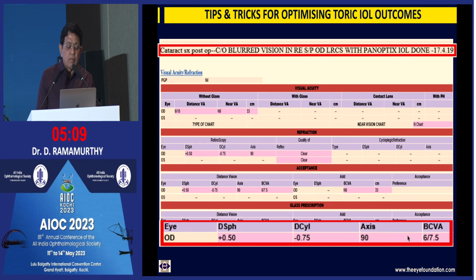It's not just the requirement for glasses, the quality of vision also deteriorates with this. But the patient was quite perceptive. We told him to wait for a period of 3 months. We ignored the cylinder, actually told him all the truth, and implanted this lens. But then you have this residual. We'll do a free laser vision correction at the end of 3 months and then take care of you.